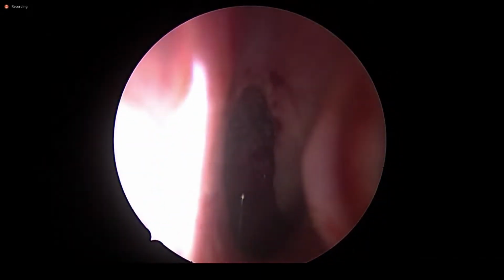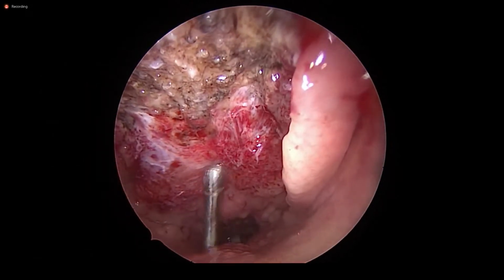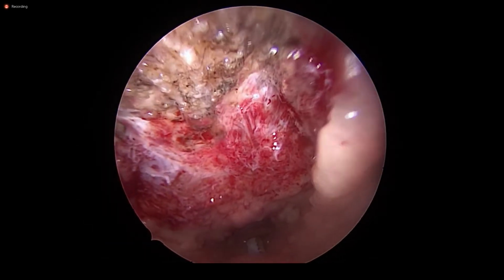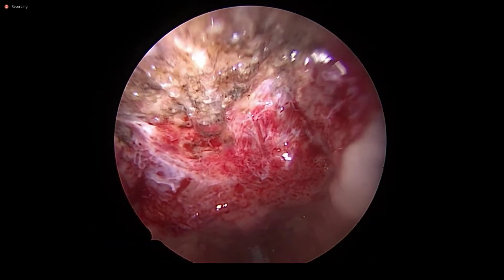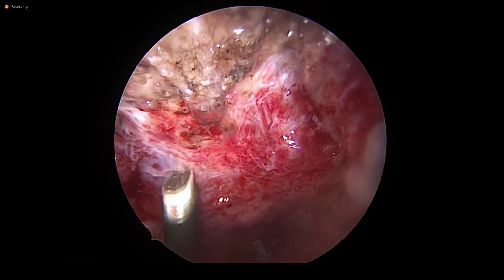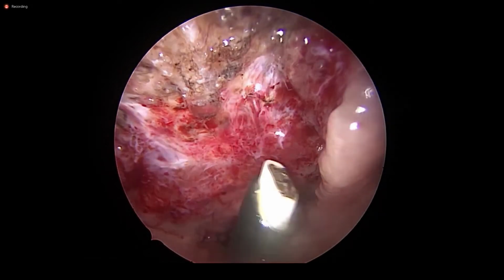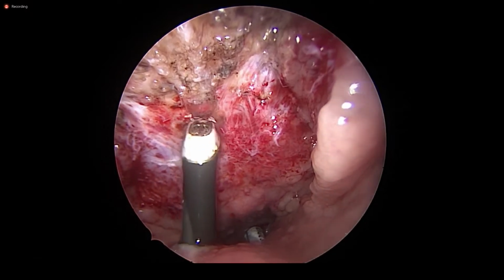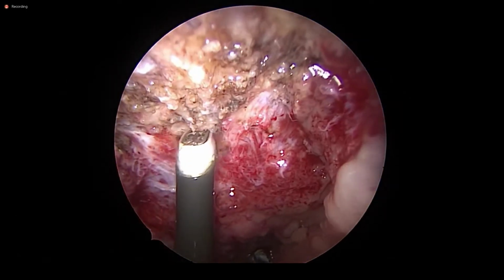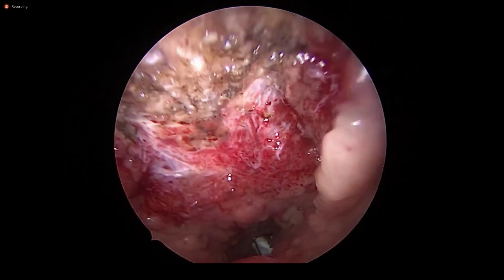Yes, sir. You want to see endoscopic sinus surgery. There are two phases. This is perimysium and the muscle behind, and periosteum above, and see, these periosteal vessels can be gently coagulated. Do not do any thorough coagulation unnecessarily, to prevent charring of the muscle. See, my muscle charring is almost zero. Can you see? Yes, sir.